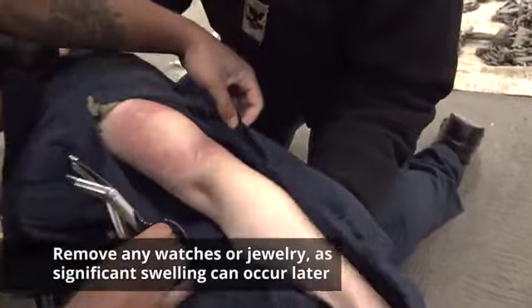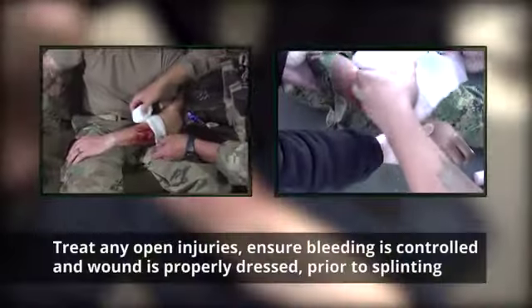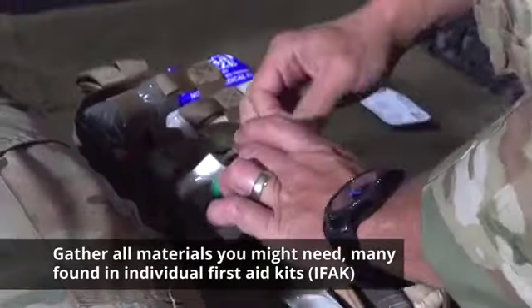Remove any watches or jewelry, as significant swelling can occur later. Treat any open injuries, ensuring bleeding has been controlled and that the wound is properly dressed prior to splinting. Gather all of the materials you might need.